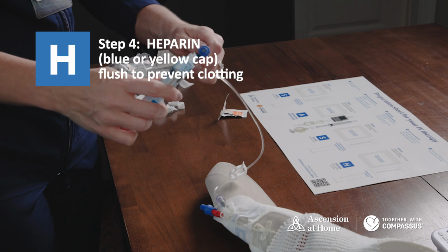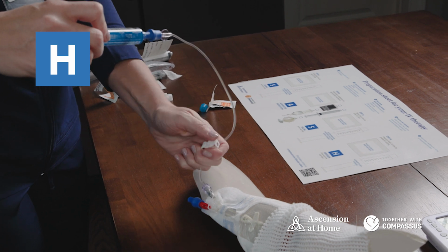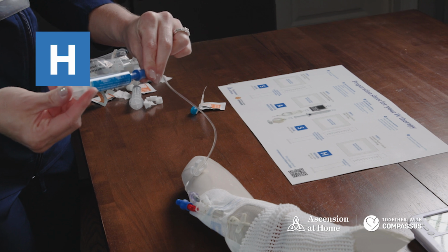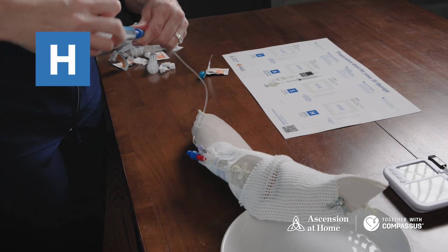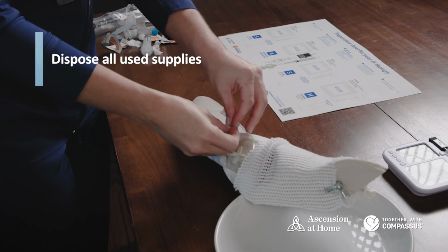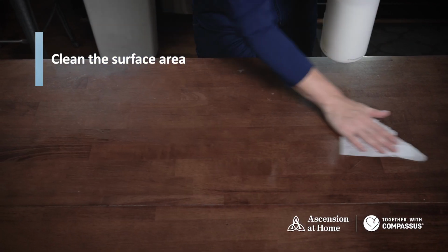Remove the cap from the heparin syringe. Attach the heparin syringe to the clave by using a push and clockwise twisting motion. Unclamp the tubing and flush the line with heparin using a pulse or a push-pause method. When the entire syringe has been administered, clamp the tubing and remove the syringe and discard into the trash. Lastly, wipe clean the surface of your work area.